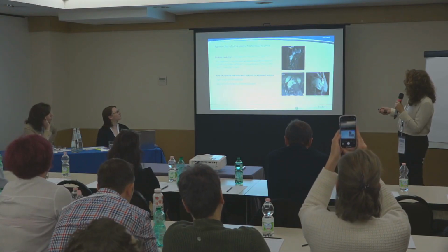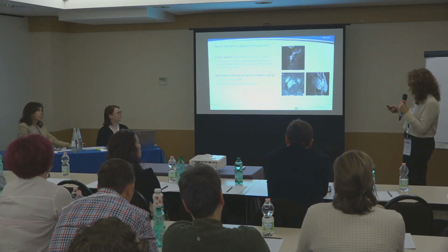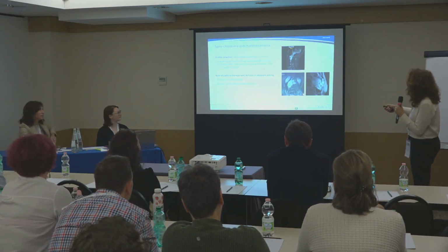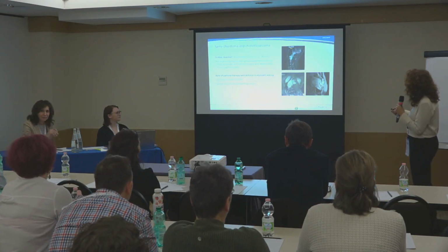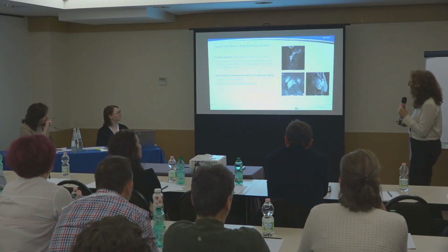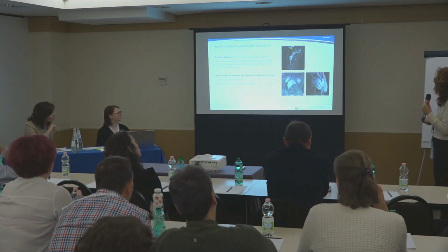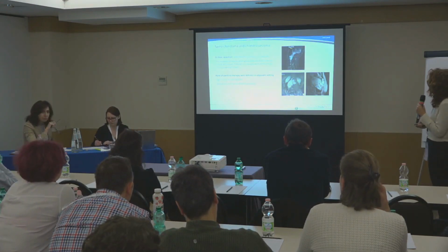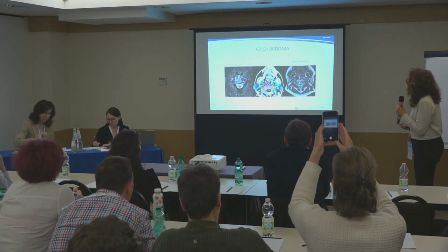Spine chordoma and chondrosarcoma. En bloc resection gives the best results, but the results are improved with adjuvant radiotherapy with high doses. So you see the critical region. So in this case too, it is important to have selectivity.